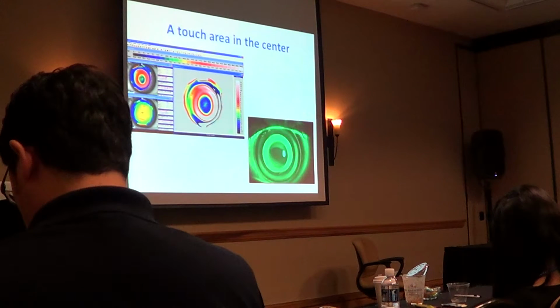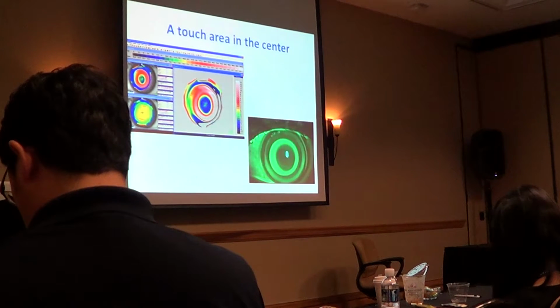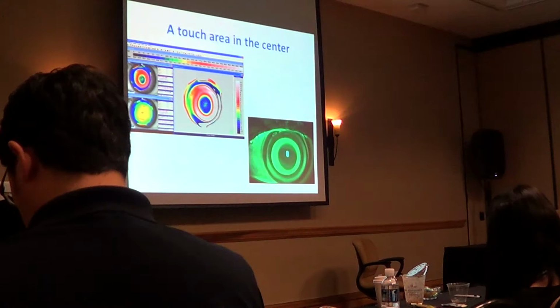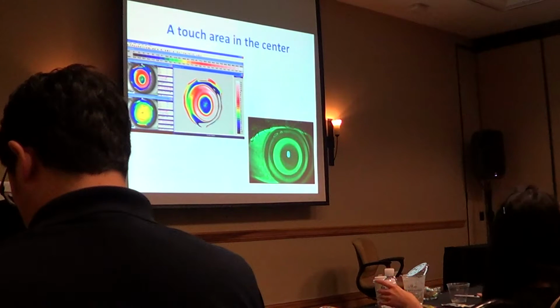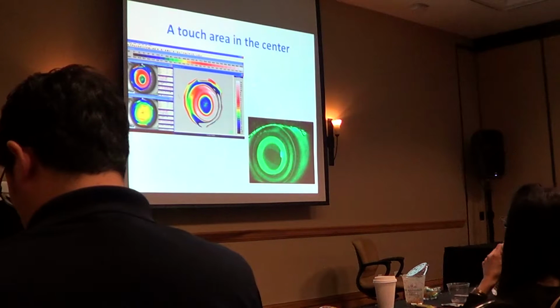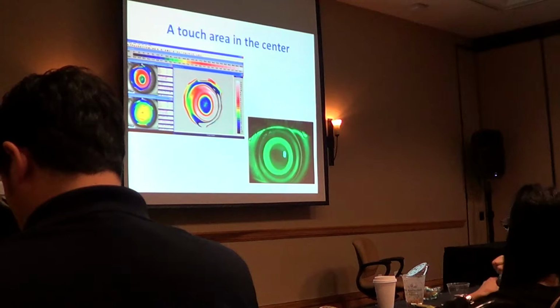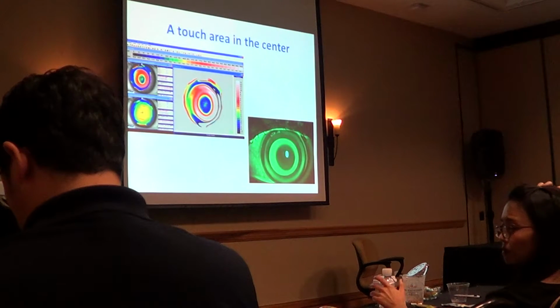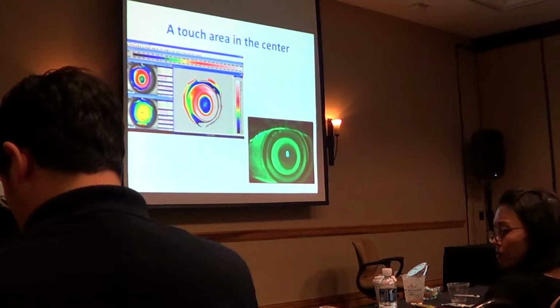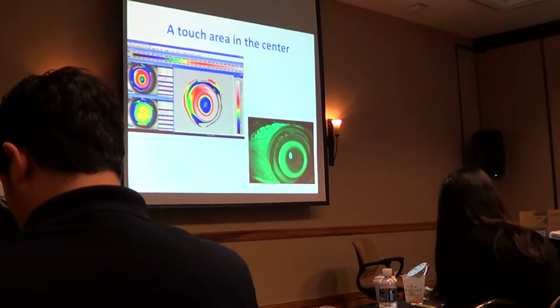But the central island that John Longford describes, a central lens with a very steep fit, I don't remember having any patient like that in my life. But maybe other lenses have that. Maybe. So I couldn't assure that. But in my experience with my lens, it never happened. But it's true, fake central island.